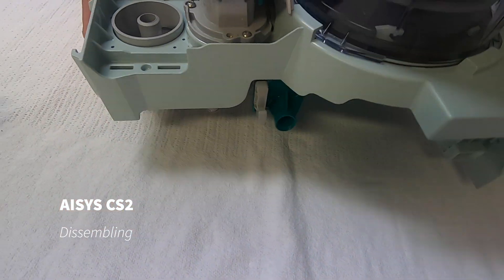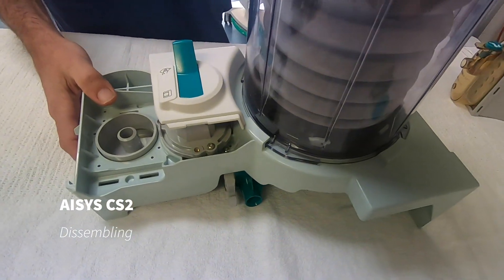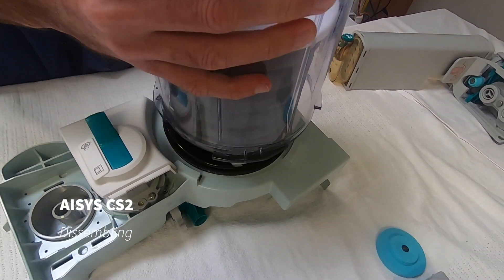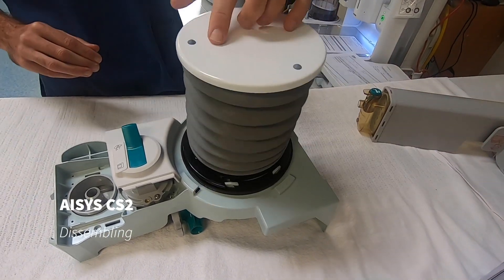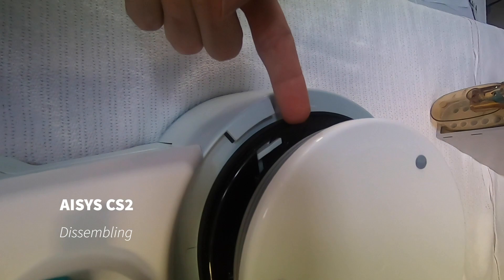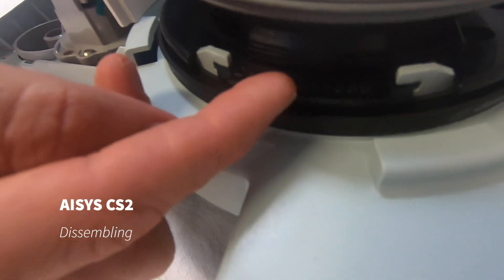Now we can proceed to disassemble the bellows. To do that, we twist and push the cover anti-clockwise and it just lifts off. To remove the bellows, we push in the spring mechanism on either side and the bellows pop off.